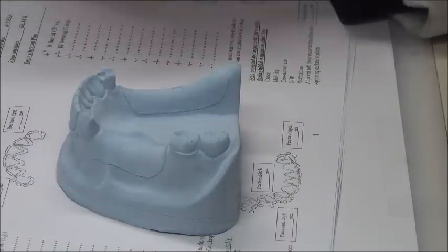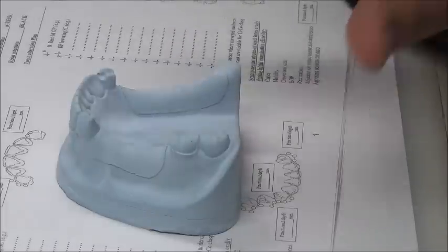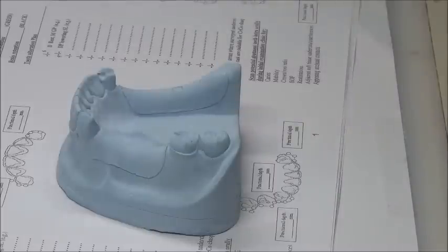For aesthetics. This is design. This is what we mean by design. We change the very basic design based on some findings. One of the findings is that our abutment is a canine.